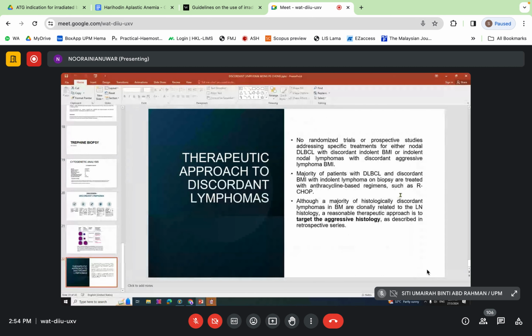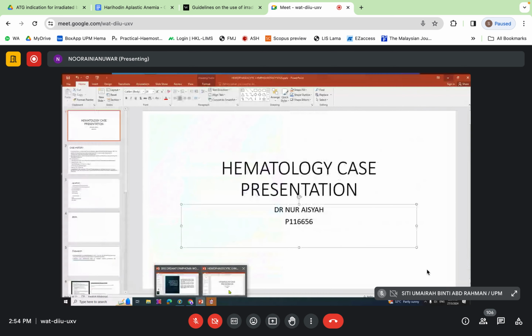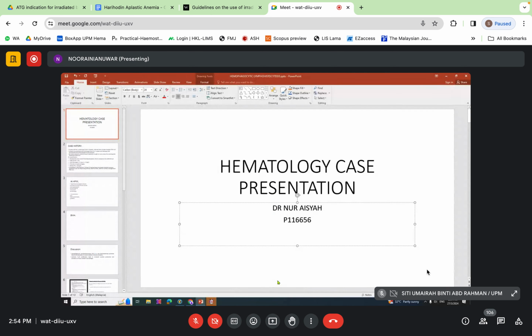Okay, I think that's all from me, Prof. Okay, thank you very much. So now you have to tell us whether this one, are they of the same clonality, the two different morphologies?